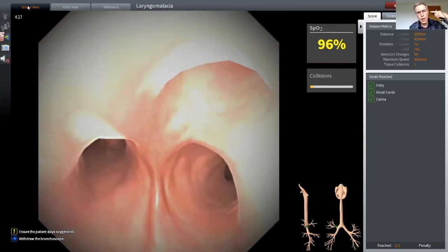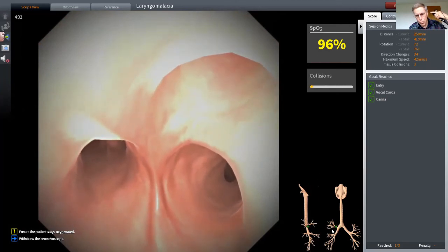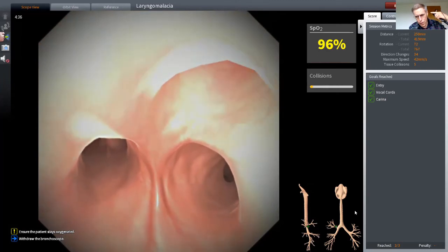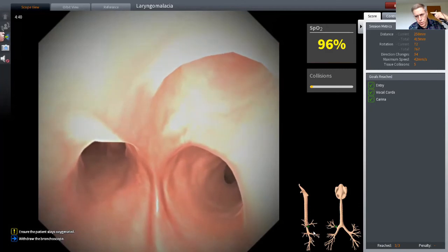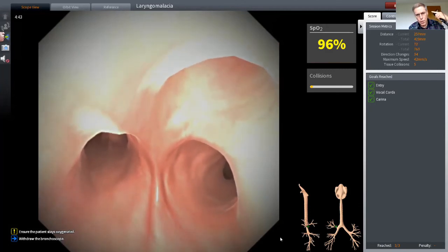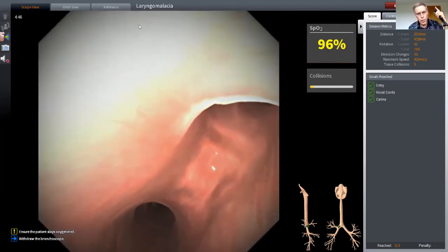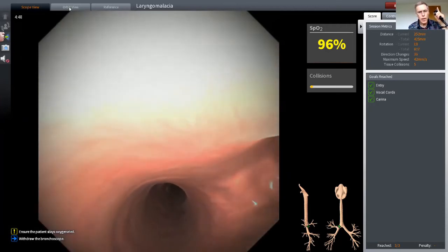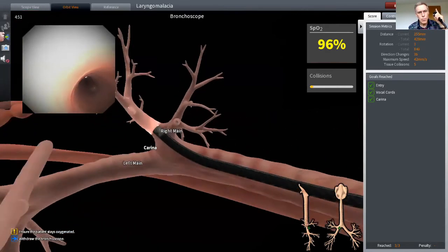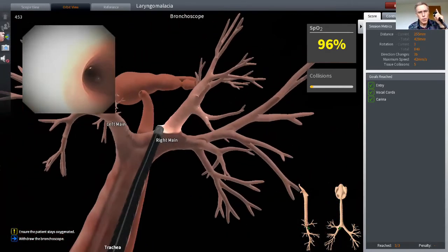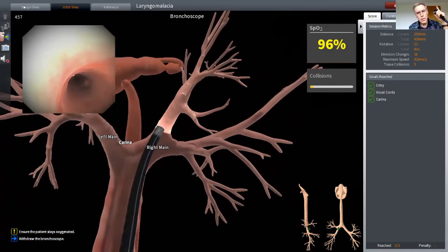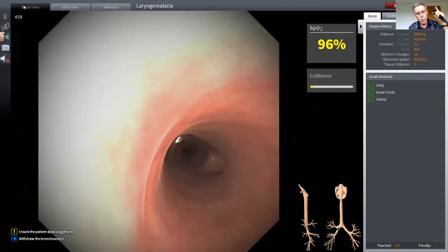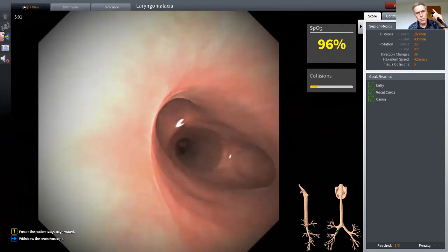And you'll see in the bottom right corner of the screen of the anatomy, two little models, one AP and one lateral, and you'll see a very small little green crosshatch that shows the position of the tip of the bronchoscope. So I'm going to come out of the upper lobe, move into bronchus intermedius, travel further down the trachea. You see now I'm in the orbit view. We get a beautiful view of anatomy, and here is the right middle lobe, and that has lateral and medial segments.